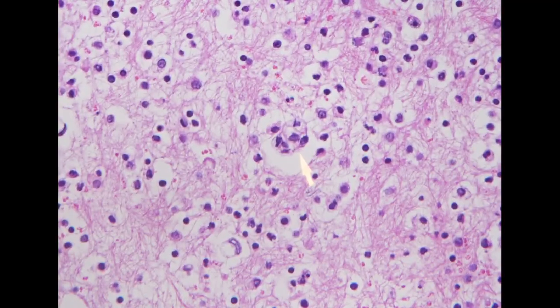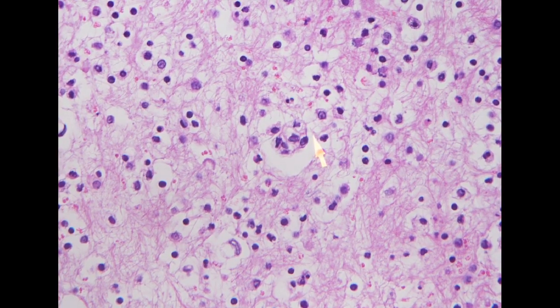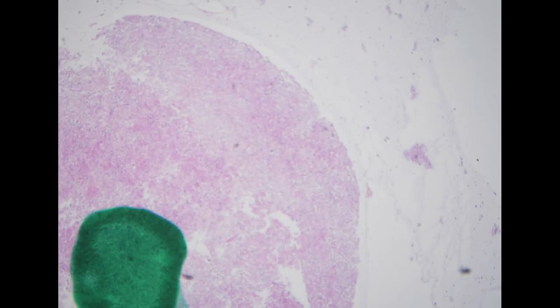So I start to do MOC31 instead of Claudin 4, because usually Claudin 4 has a very faint staining, sometimes very difficult to interpret. So I think this is positive for adenocarcinoma. Just because of the low tumor component, we would check it with the ancillary marker for confirmation.